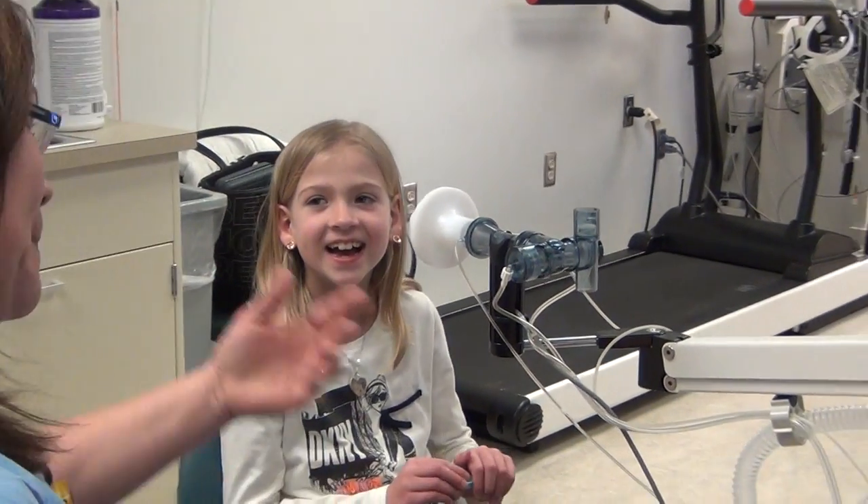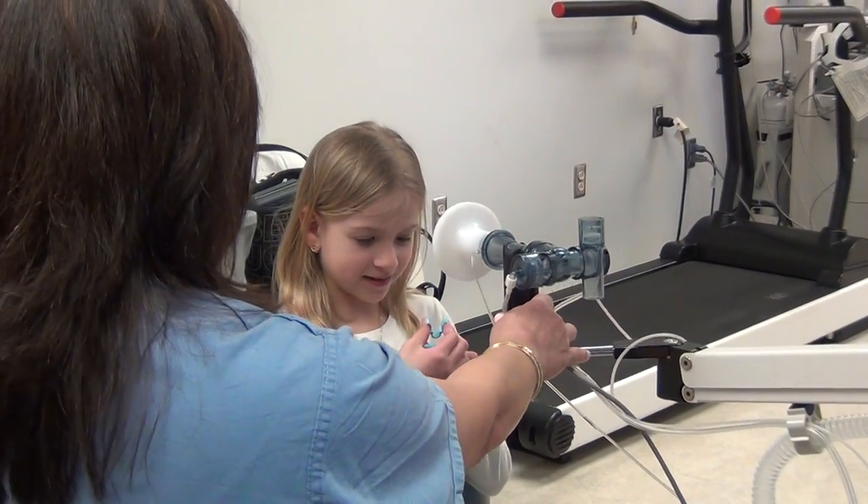Sound good? Okay, let's try it. Let's do it. So sit up nice and straight.